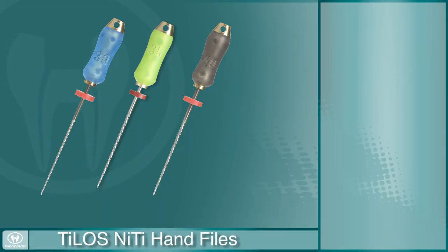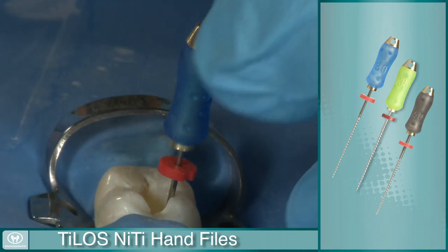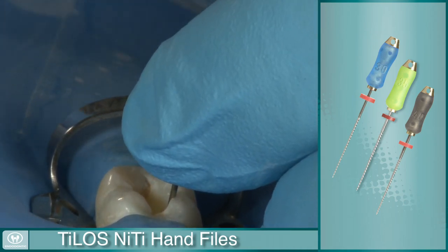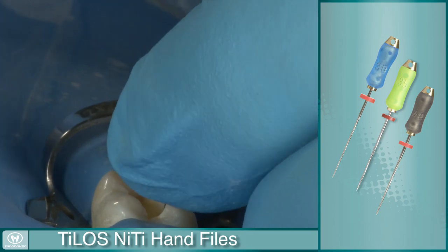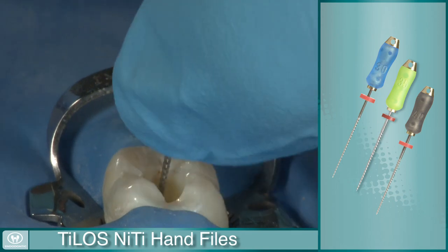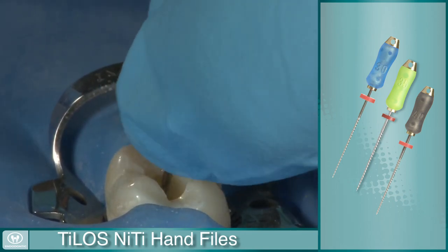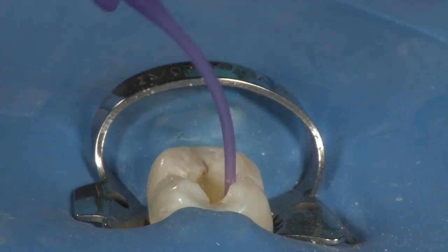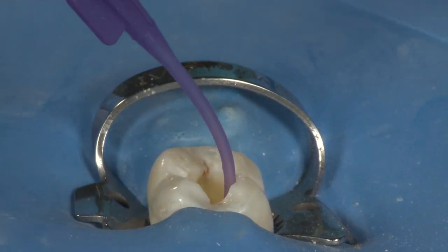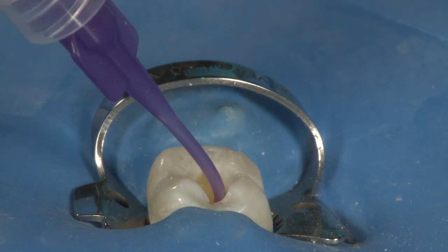Ultradent believes the safest and most accurate way to finish enlarging the apical opening is by using hand files. Use the Telos NITI hand files to finish the apex of the canal. It is generally recommended that you enlarge the apex three to five sizes larger than your apical instrument — the first file that went to the apex with some resistance. Now that instrumentation is finished, a final irrigation procedure will complete the cleaning and preparation of the canal for obturation.